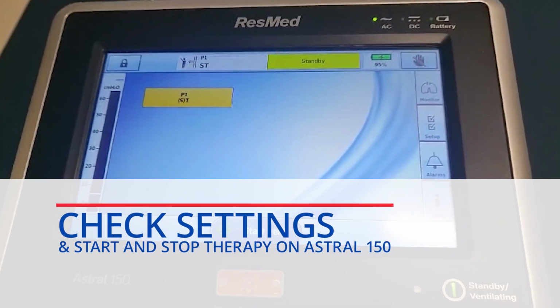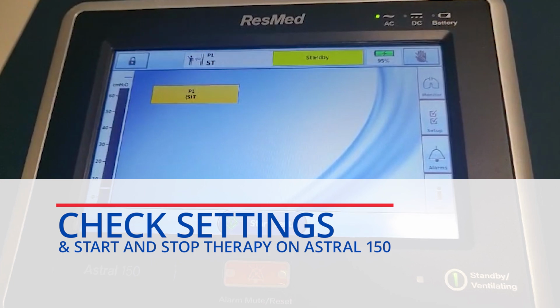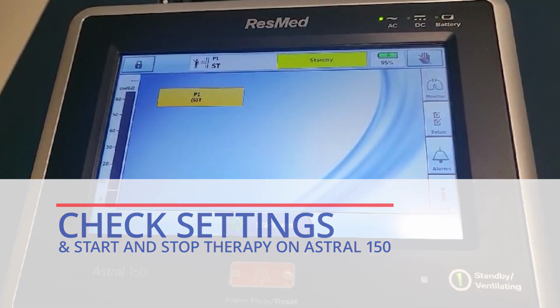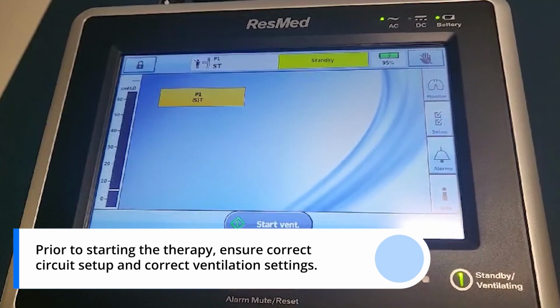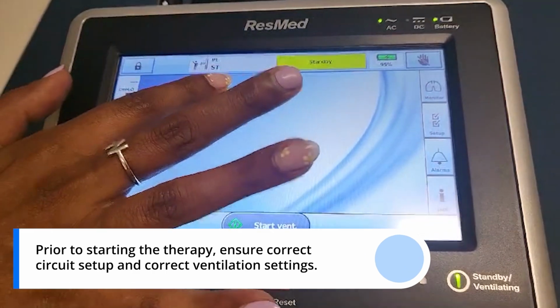This video will review how to start and stop ventilation therapy on the Astral 150 device. Prior to starting the therapy, ensure correct circuit setup and correct ventilation settings.